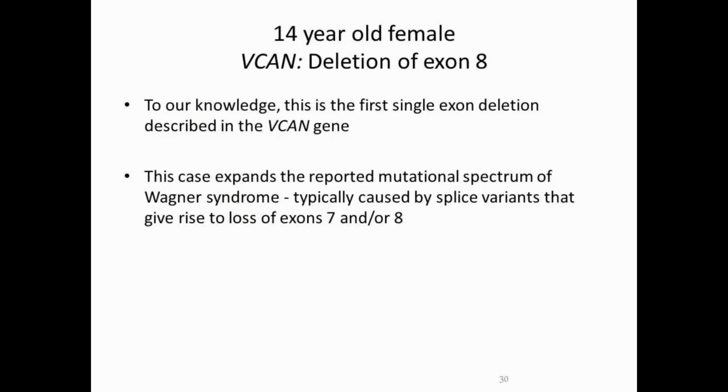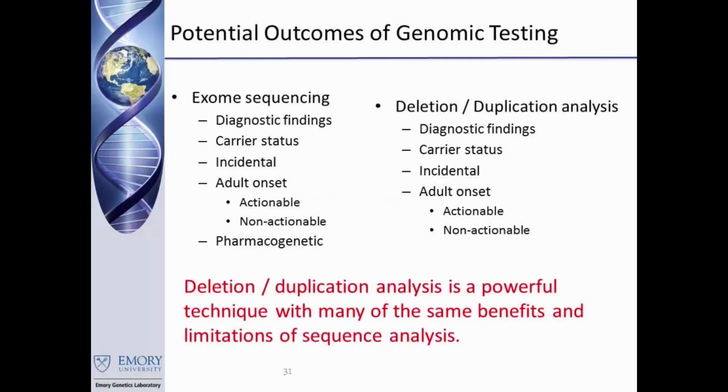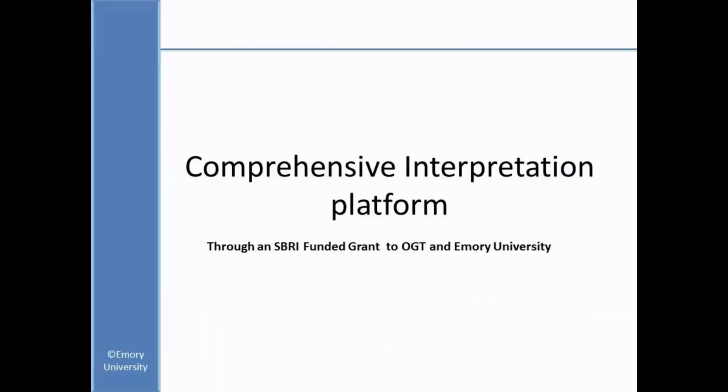So essentially what I'm trying to say here is that the exome sequencing followed by array-based copy number variation is highly sensitive. What I tried to show you is single exon deletions, which kind of highlights the sensitivity of these arrays as well. And it very well complements what we are trying to do in a clinical laboratory to achieve a final diagnosis for a child with sort of multiple clinical presentation.